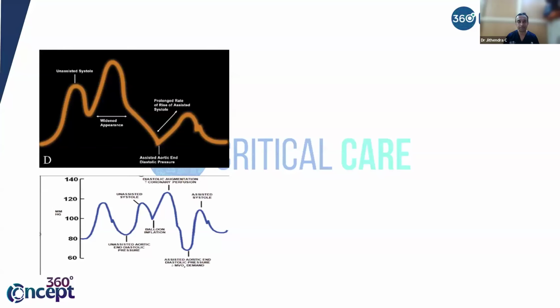So what is left behind? So this is the thing. What is happening here? So anybody? This is late deflation. You can see very late it is getting deflated. I mean, it is easy. So obviously there are only 4 errors in timing. So I finished 3 of them.